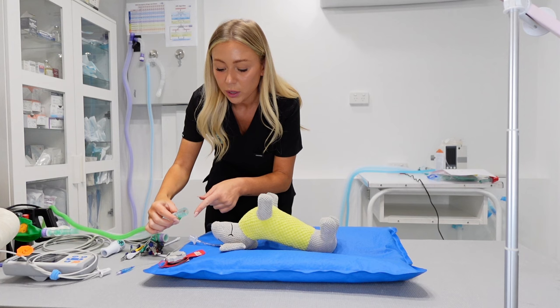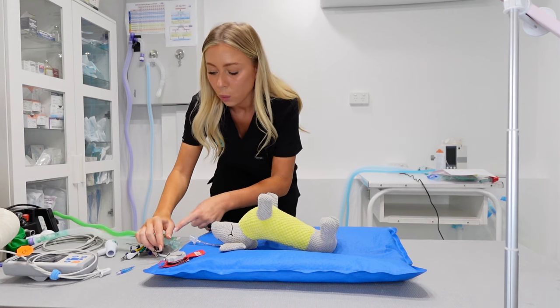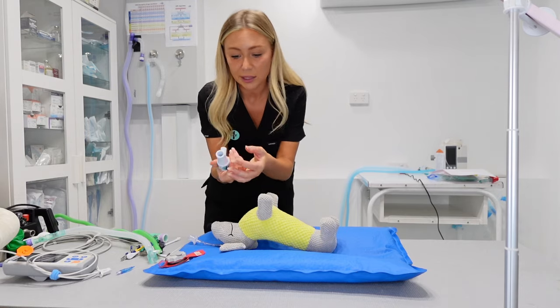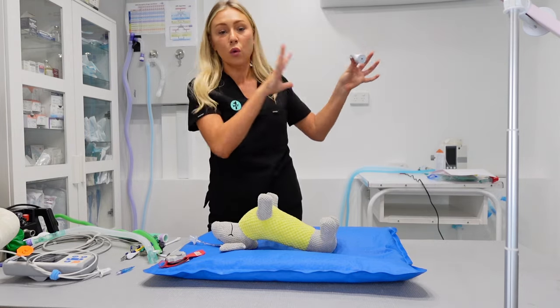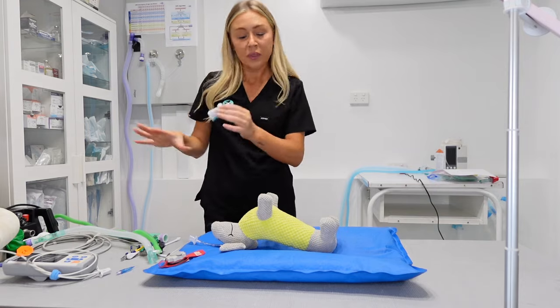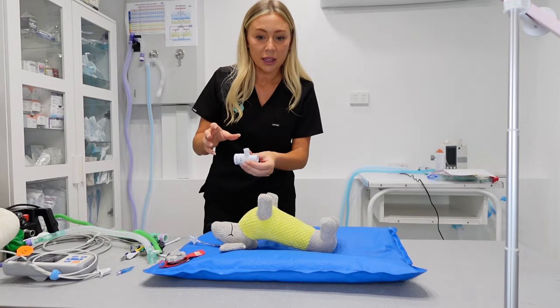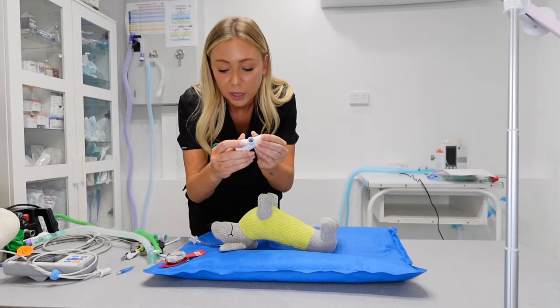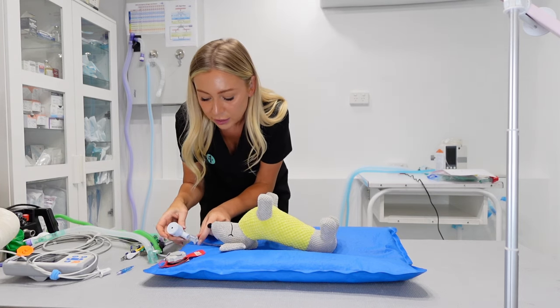I've got oxygen running in. Before I attach this, I want to attach my respiratory monitor. This one is just like a little handheld, it's got a battery in it. You can attach it and keep it at all your anaesthetic monitoring — anaesthetic machines within the clinic. I think these are really, really useful. All you do is turn this little button on here and attach this end to the patient.